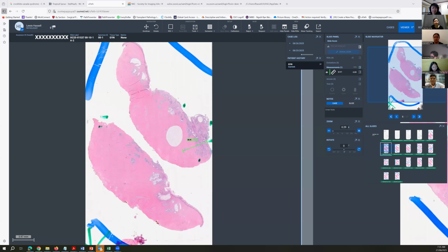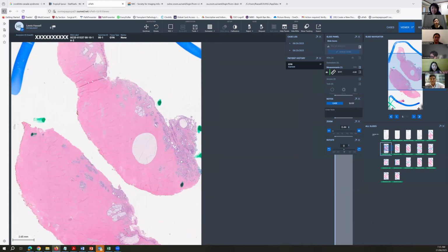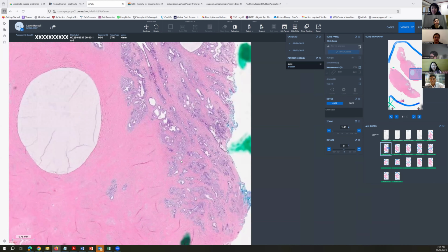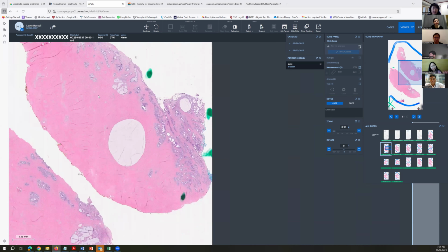Okay, now I can share again. So just for your benefit, the United States has very strict penalties if you disclose patient clinical information in a setting where it's not appropriate. And so when I have that setting on my viewer here, I can't look up the case quite as easily. So anyway, here's a section of cervix.